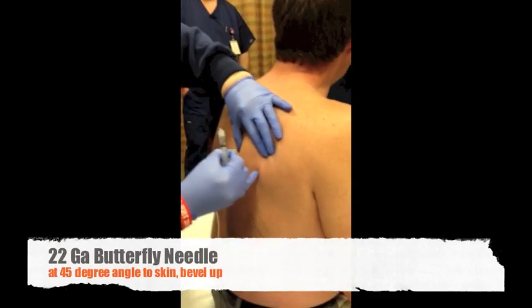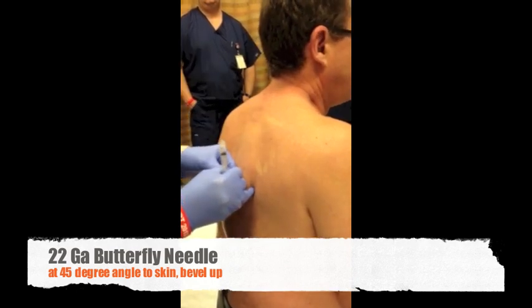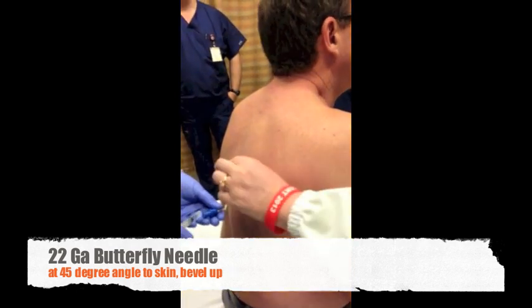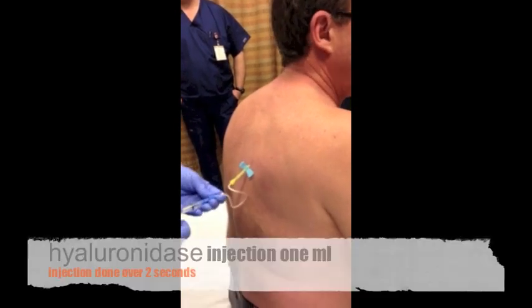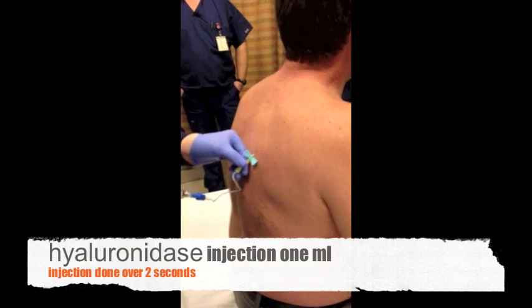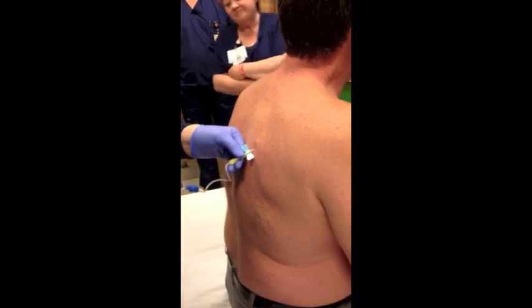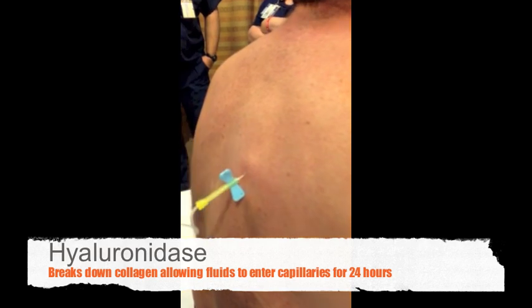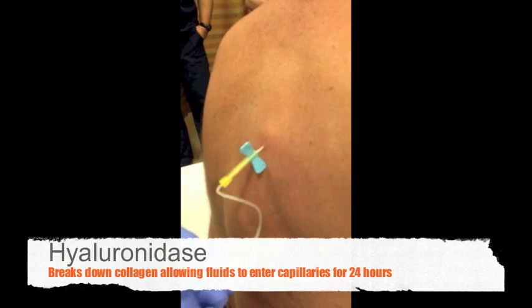Are you ready, Dale? Just do it. While I'm holding on to mom, I don't feel anything right now. I feel a little bit right there now — it's the wheal. It's a wheal.